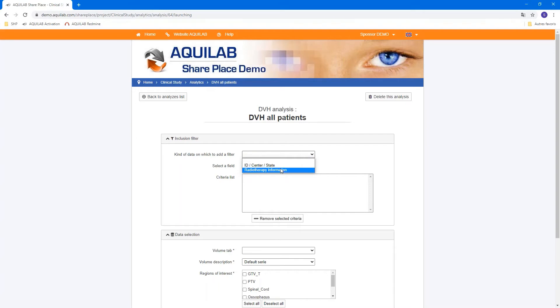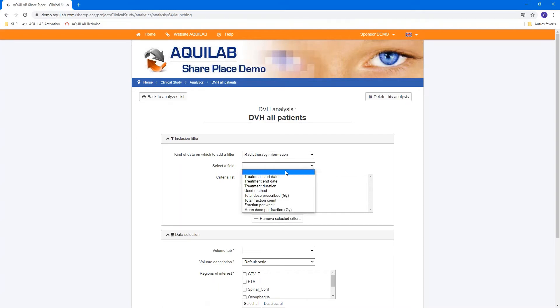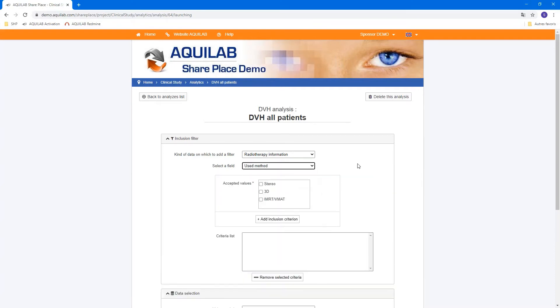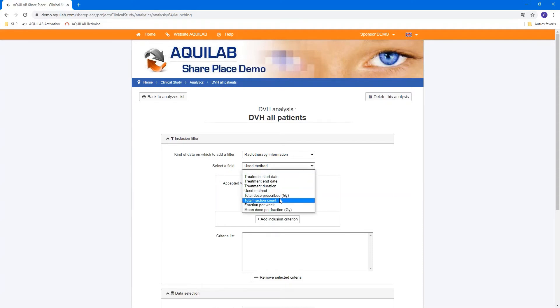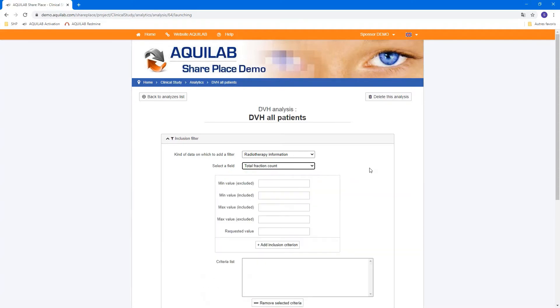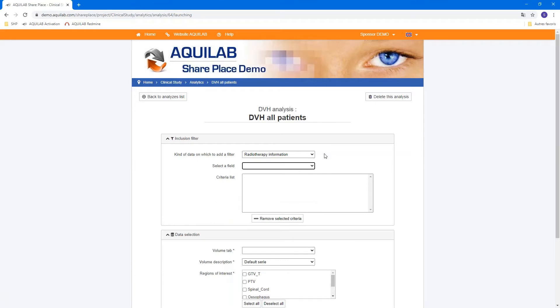For this analysis, you can parameter with filters what you want to include in this analysis. You have, for example, radiotherapy information we have seen in the previous tab. And you can choose, for example, used method or total fraction count to filter.